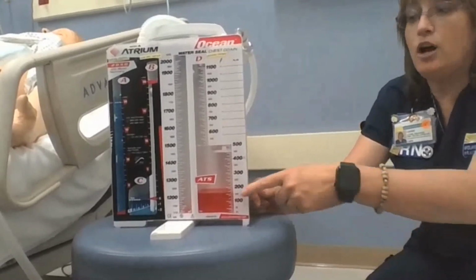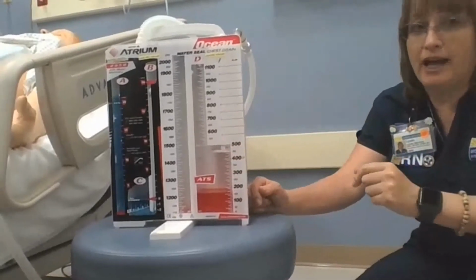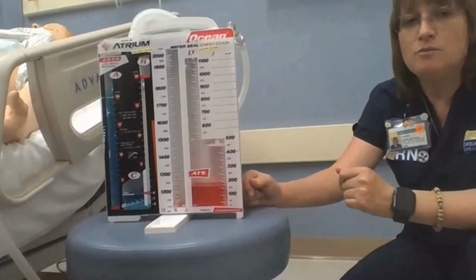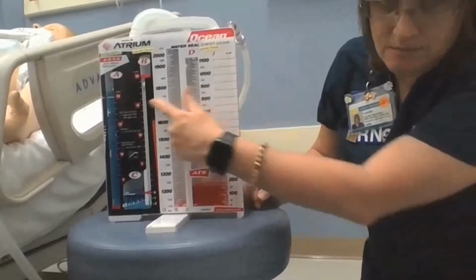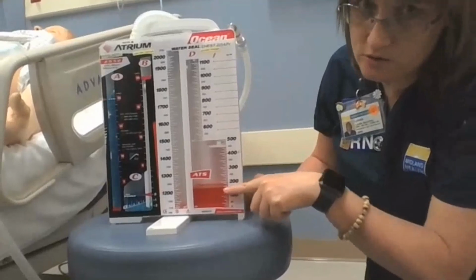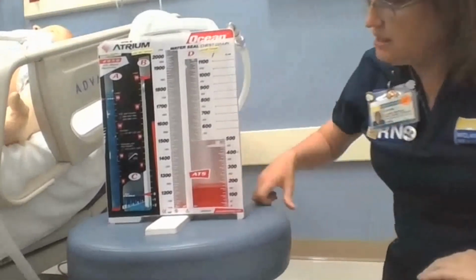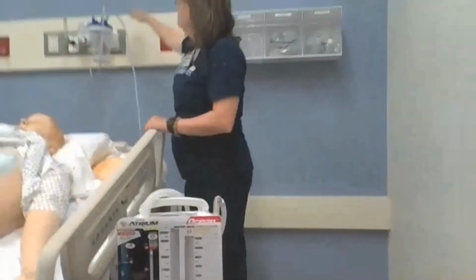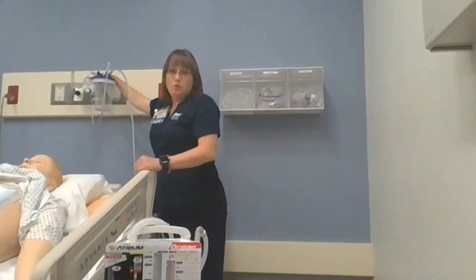But if you've already got lines going all the way up here and you've taken up every room and you're going, I can't accurately count or see where my line is, then you might need to change out the atrium. So you want to make sure that the atrium is intact, and then you'll want to make sure that you've marked with date and time where your drainage is. The very last thing we're going to look at is up here on the wall, and it could be in the green to low wall.